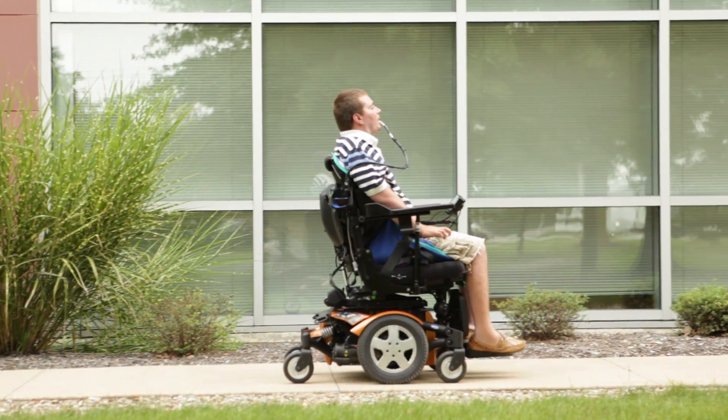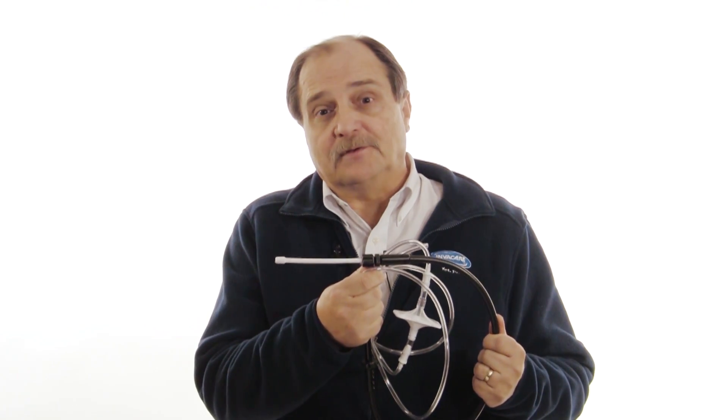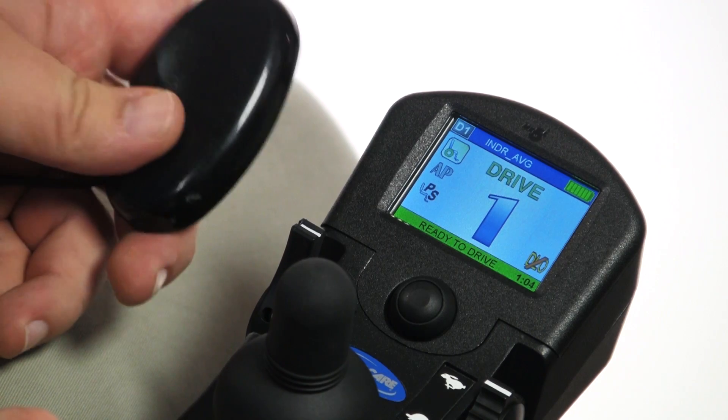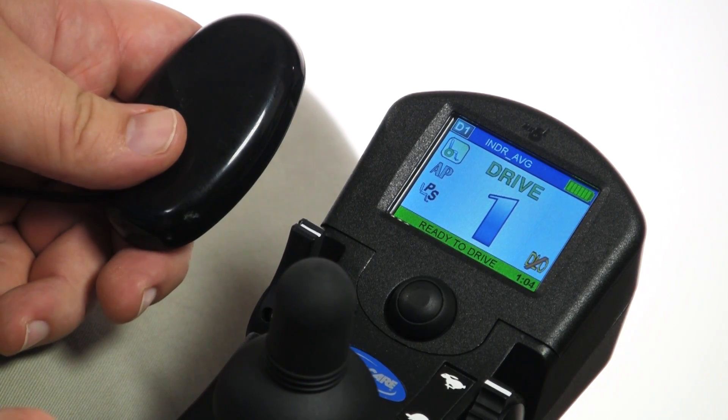Other driver controls that are common to put into a latched mode include shin controls and pneumatic or sip-and-puff controls. All manufacturers require an external emergency stop switch to be on any power chair operating in a latched mode. Any switch will do, mechanical or electrical. And remember, any switch on the chair being used as an external mode switch or a reset switch is also always an emergency stop switch.